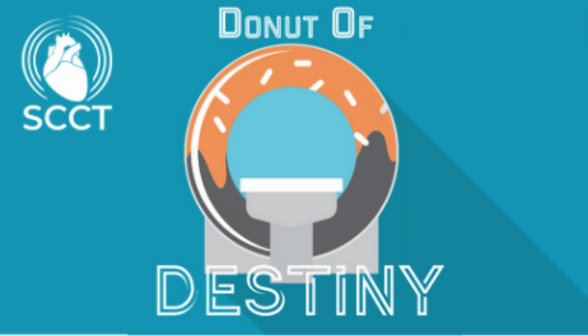And a very interesting, discordant concept between CT specialists and interventional cardiologists is that we believe that the vulnerable plaque should be the primary target for the PCI. But what I learned from CT studies and CT specialists is that the vulnerable plaque is the most high-probability plaque that regresses.